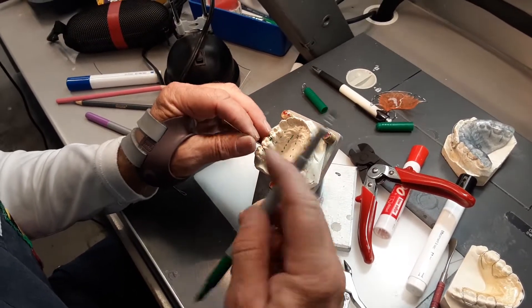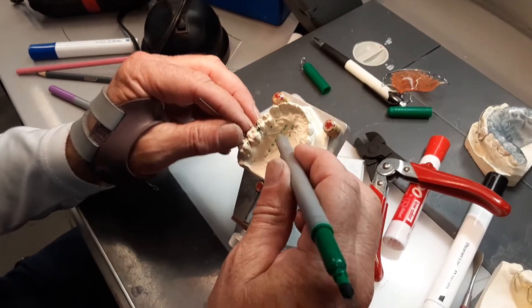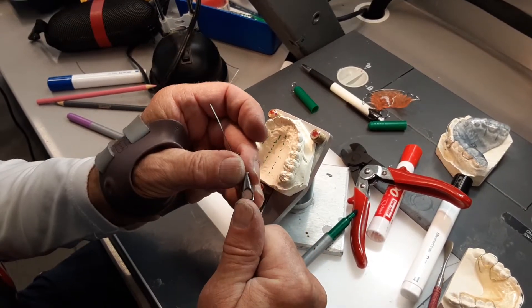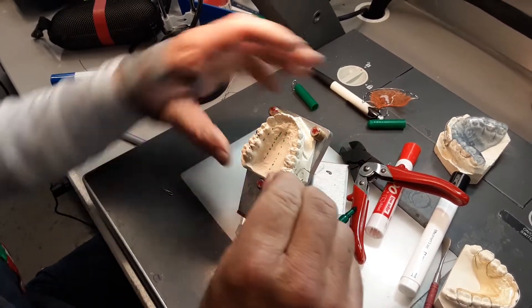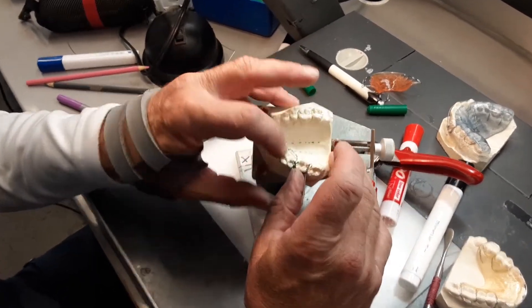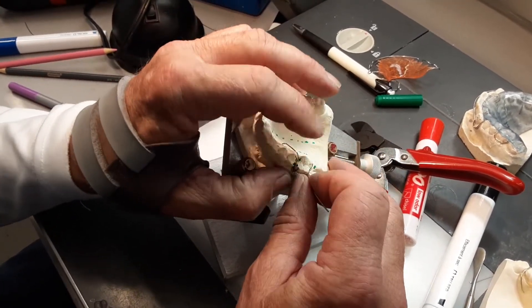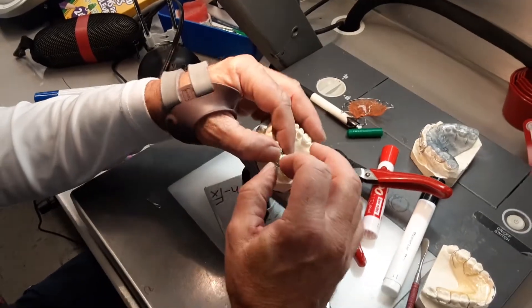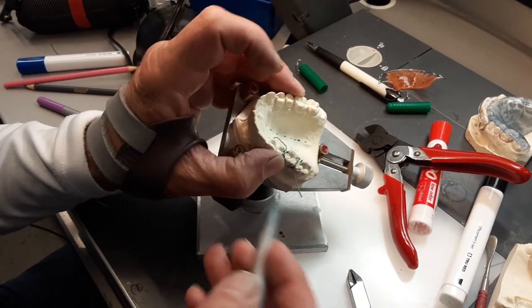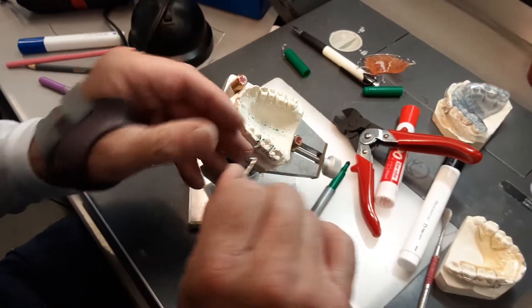We're going to make a dog leg retentive tag, so I want to bend that so it's perpendicular to the wire here. I'm going to grab the last two millimeters of the wire and bend it down at about a 30 degree angle until the wire just touches the palate there — that holds my tag off of the tissue. My eyelets are in the preparations, so we now have three points of reference: the two eyelets in the preparation and the dog leg tag there.